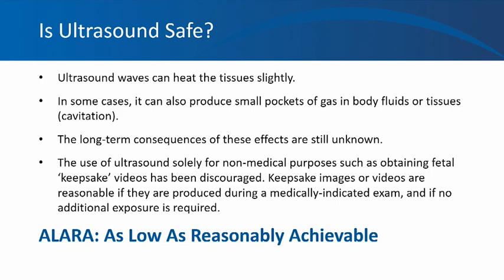And we follow the principle of ALARA, that means as low as reasonably achievable, which is a safety principle used in radiology designed to minimize radiation doses. Though ultrasound does not use ionizing radiation, it's advisable to minimize unnecessary exposure.